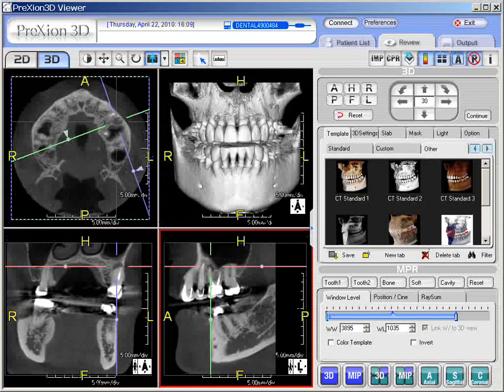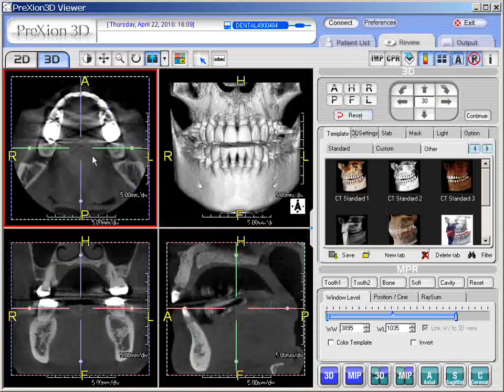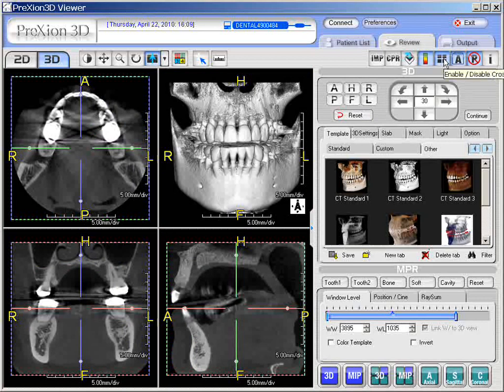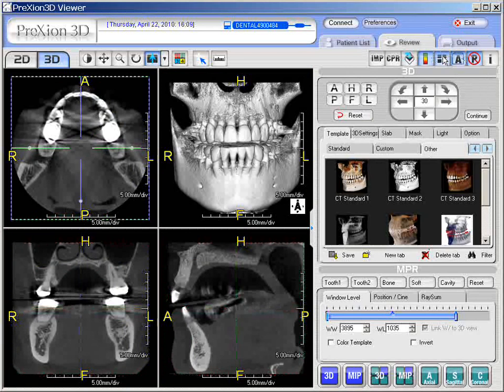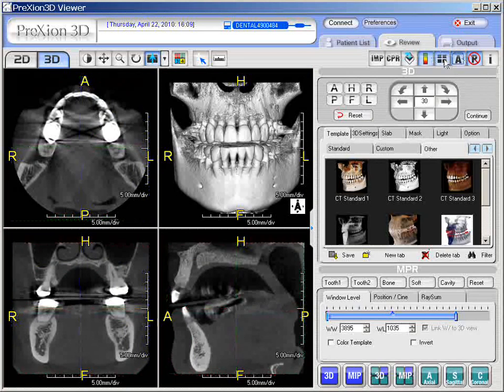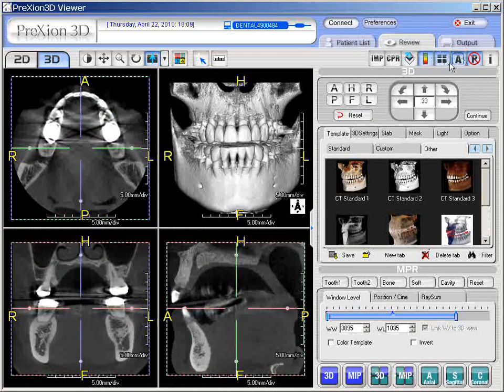To go back to the original position, we press the Reset button. If one wants to turn off the crossbars, go up to the right-hand corner toolbar to the four squares to enable or disable the crossbar, and then just click it off or on — it's like a toggle switch. So if you don't see crossbars, come up to this section and turn them off or on. That should conclude this section on using the crossbars and the manipulations in the three planar views.